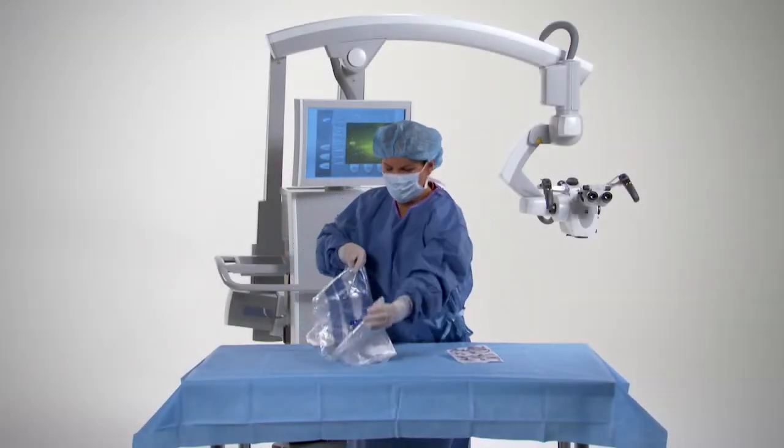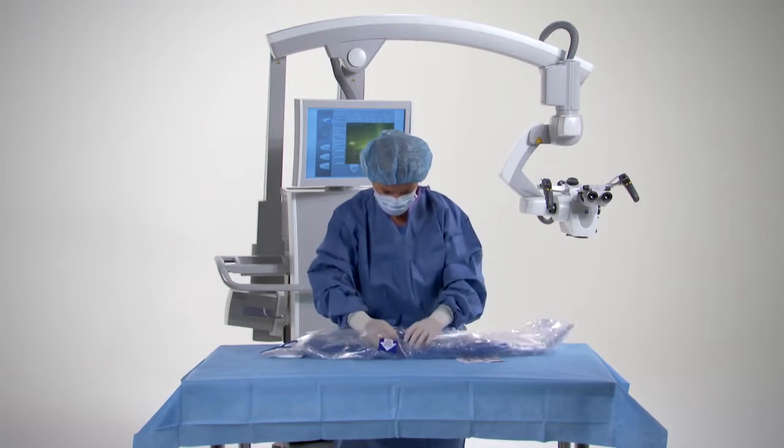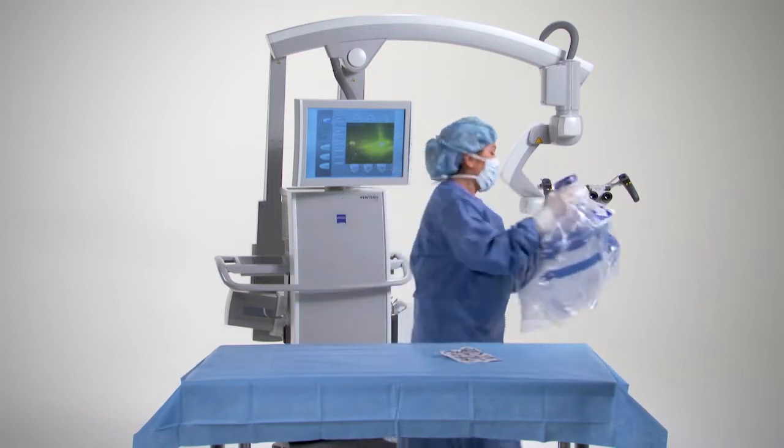To drape the microscope manually, make sure that the drape button on the touch screen is inactive. After unfolding the drape, insert your hands into the special positions indicated by the stickers on the drape.